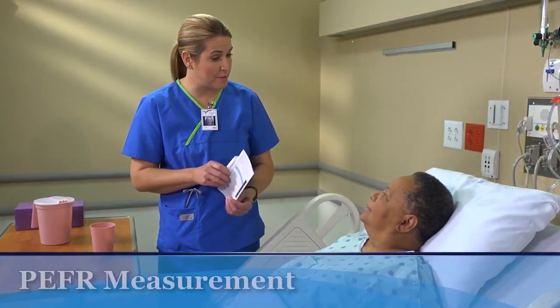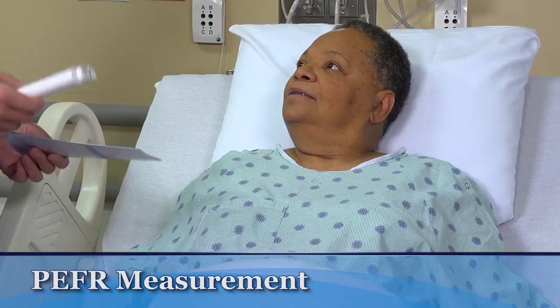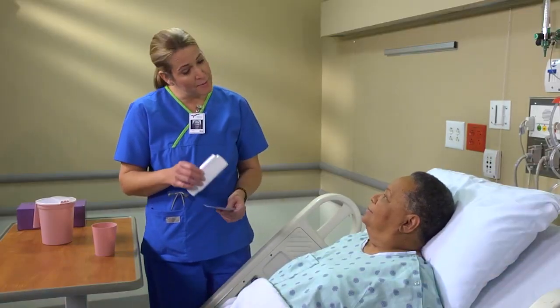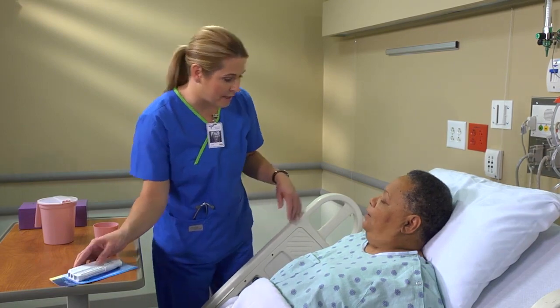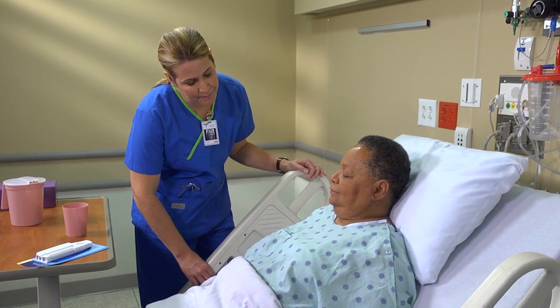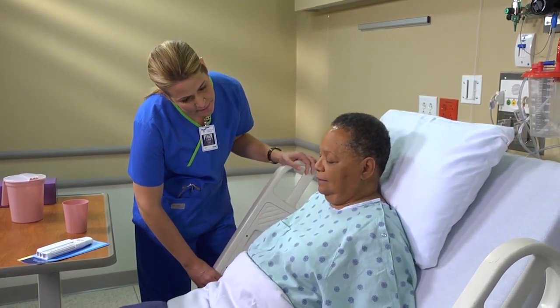Ms. Jones, I have a peak flow meter for you. This is a tool we use to assess your breathing. This is something you can also do at home to realize when you need to seek help. To assess the effectiveness of any airway management technique, measure peak expiratory flow rate, or PEFR. Explain to the patient what PEFR is and why it's helpful to keep track of it.